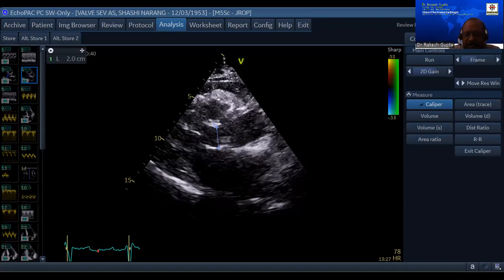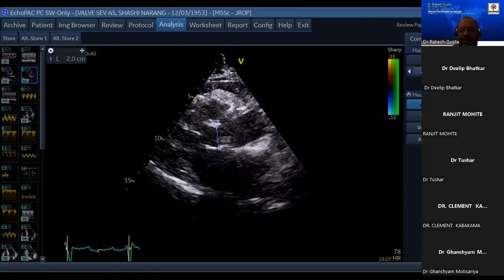Of course, the only factor in that particular phenomenon is we have to get rid of LVOT diameter completely. We do not consider LVOT diameter in dimensionless index. So in case you have a problem with calculating LVOT diameter, then the answer is you get just the dimensionless index. That will give you a fairly good idea what exactly this is.